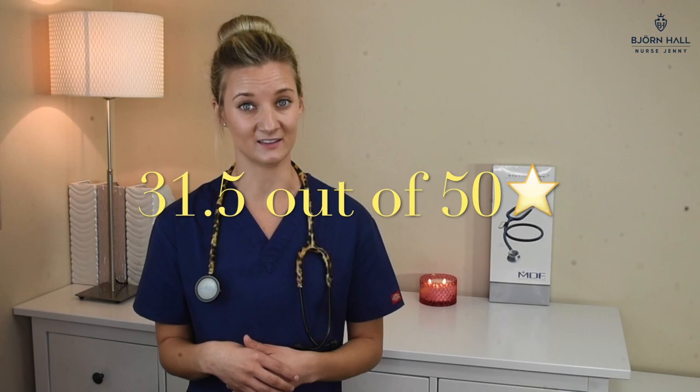This stethoscope has received a score of 31 and a half out of 50. I really enjoy the print — it is personalized, it is different, and it is hard for anyone to steal it. Unfortunately, the bubbles on the tubing and some of the print missing brought it down a little. I really like the design of the chest piece — it is nice and sleek and turnable. The eartips are super nice, comfortable, and soft. For my personal liking this stethoscope is a little bit too long at 78 centimeters, or 31 inches, but if you like a long stethoscope, this is the one for you — it is one of the longest ones out there.